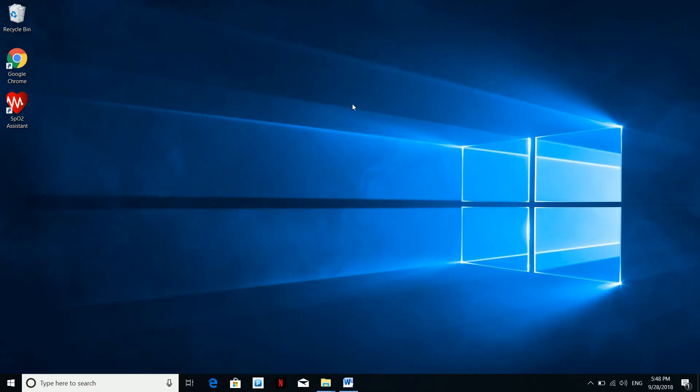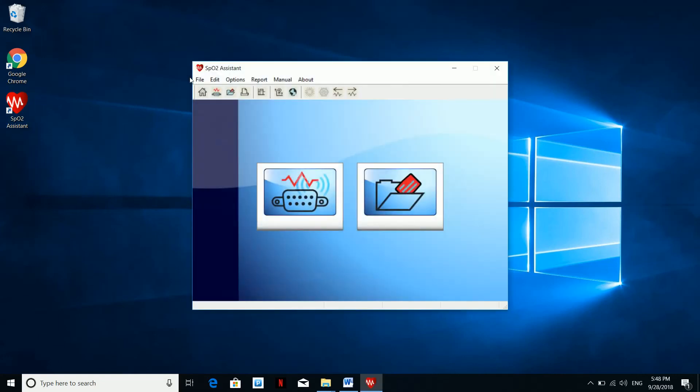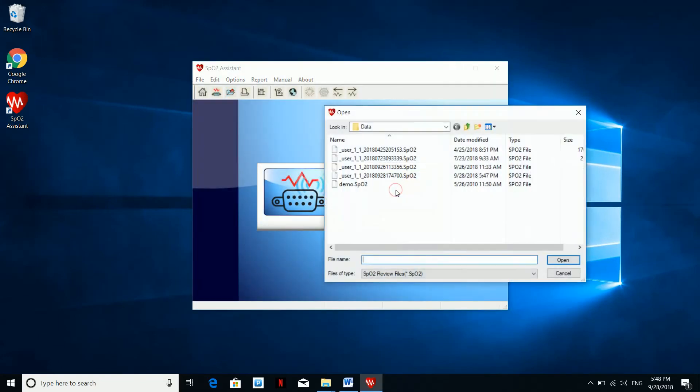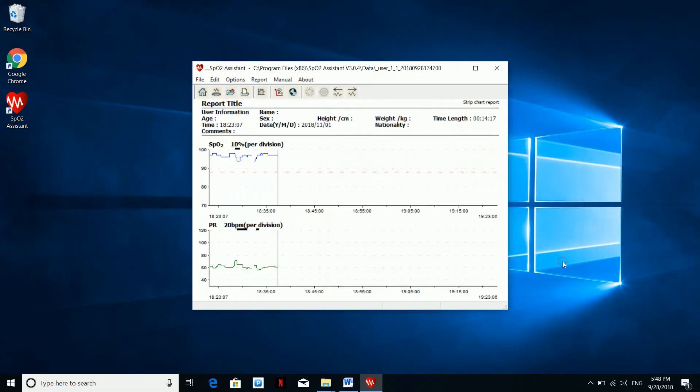In case you need to access the report in the future on the same PC, simply open the software. In the home screen, you will find the open folder option and click on that. Select the name of the file you want to open and hit open.